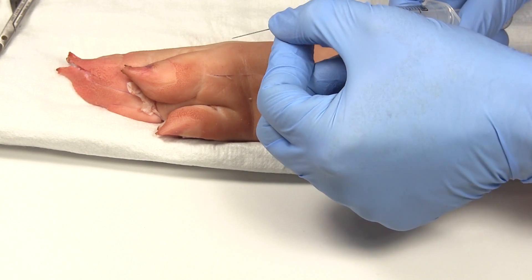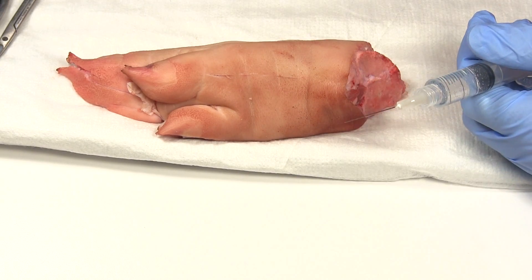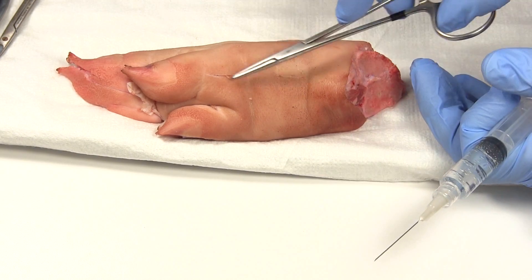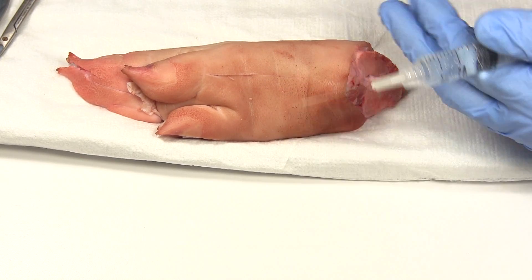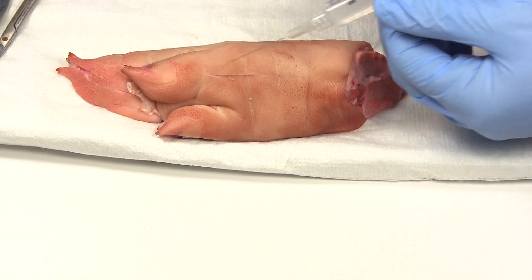The idea is that if the needle is straight and you have your laceration right here, you don't want to go poking at the laceration that way.